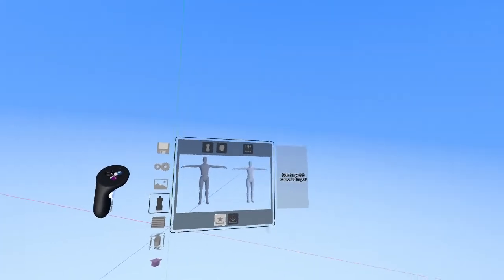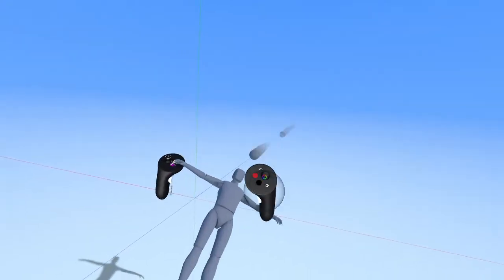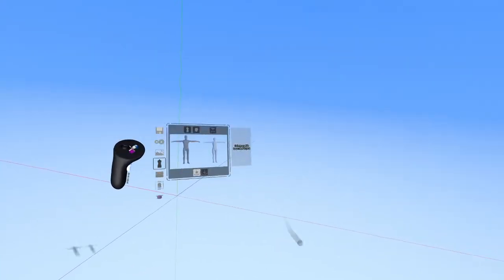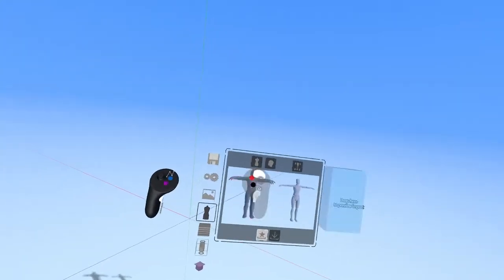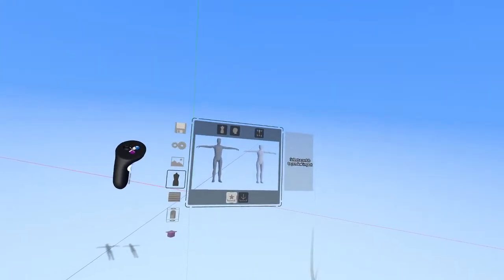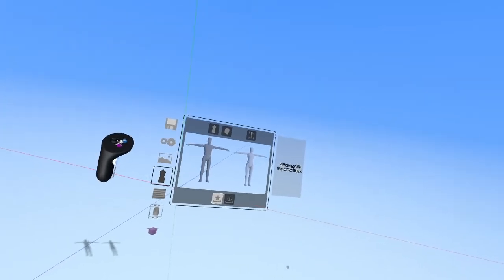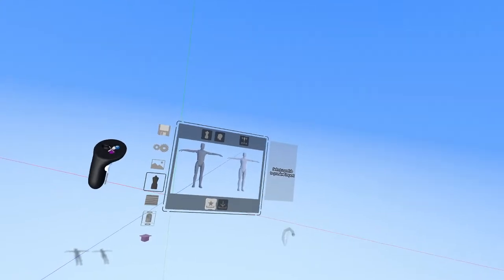So you can grab a mannequin, drag them out like this, and start to use them in your scene. You can scale them up and down, do all sorts of things, but it's not at one-to-one scale. It's just at whatever scale you were at whenever you dragged it out into the space. And we want to make sure that our mannequins are at one-to-one scale so that we can start designing with confidence that the solution we're building is actually going to help people in real life.